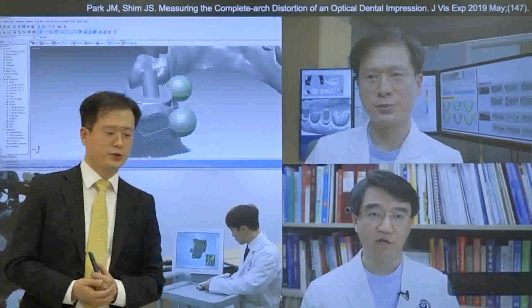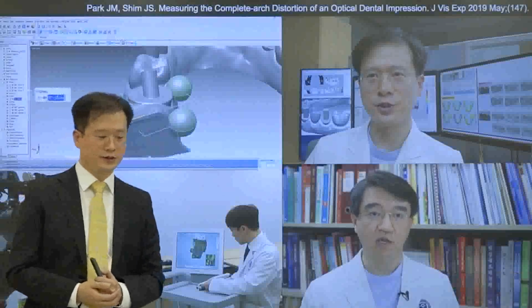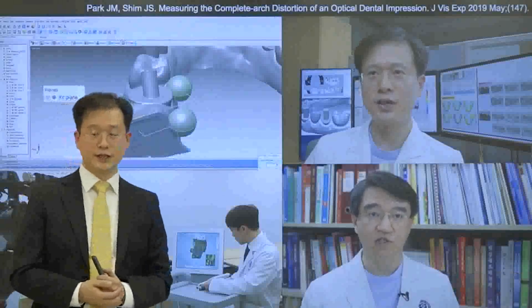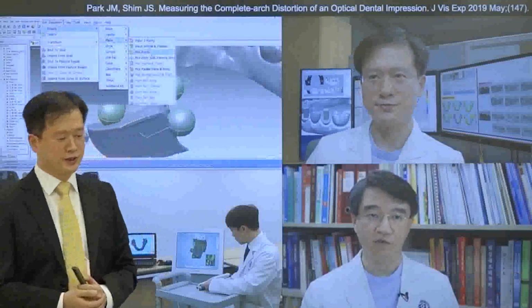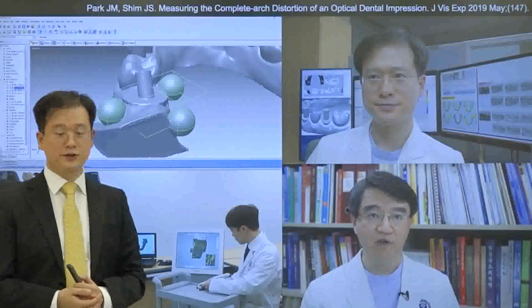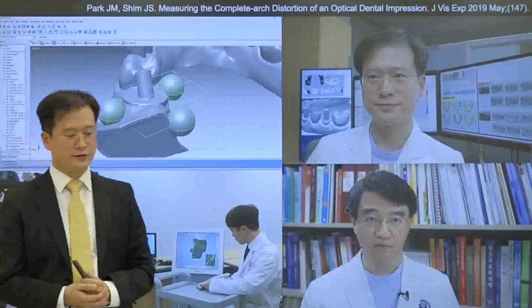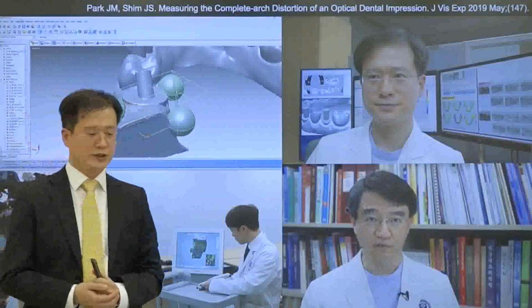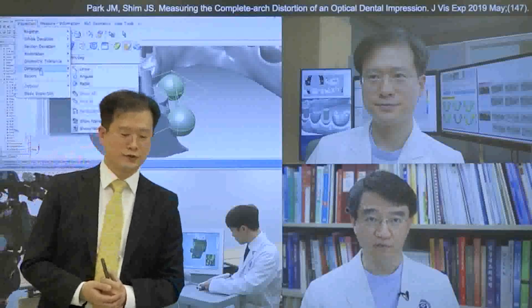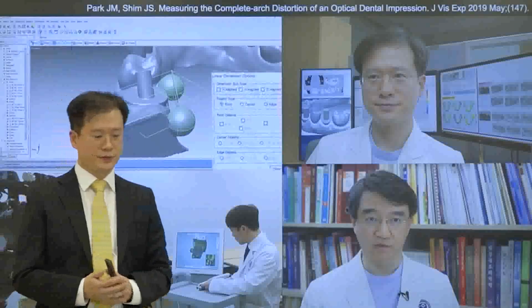One of my research projects is to evaluate the currently introduced latest scanners using this model to assess the most significant vulnerability of intraoral scanners, which is the distortion of the arch.